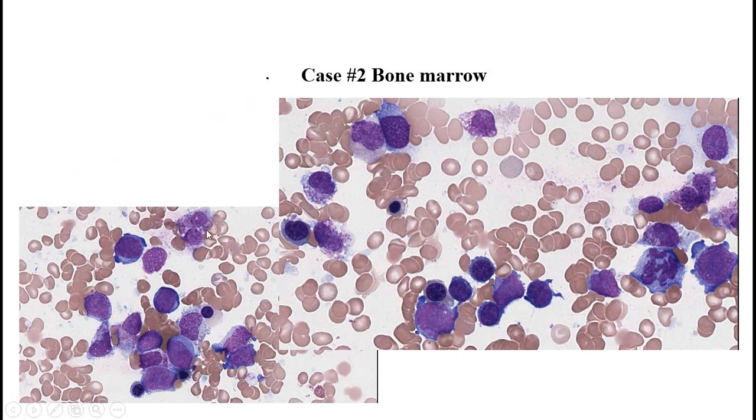And same here, some of them are mononuclear, some of them binucleate, and there are some blastish-looking cells. This one is binucleated, this one is sort of binucleated, and the granules are getting larger than in some of the other ones. So, same as here. On initial look, someone may even call it myelocyte. But when you look closer, the cell that comes to mind is, could this be basophils? Basophils generally can look like that in the peripheral blood too, except they can be washed out as well. So in this case, it looks like a washed-out basophil.